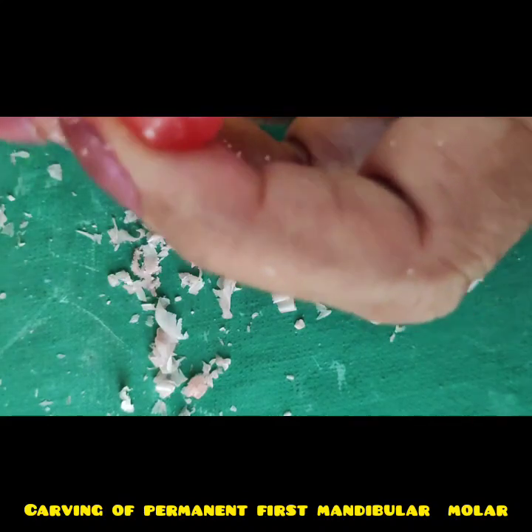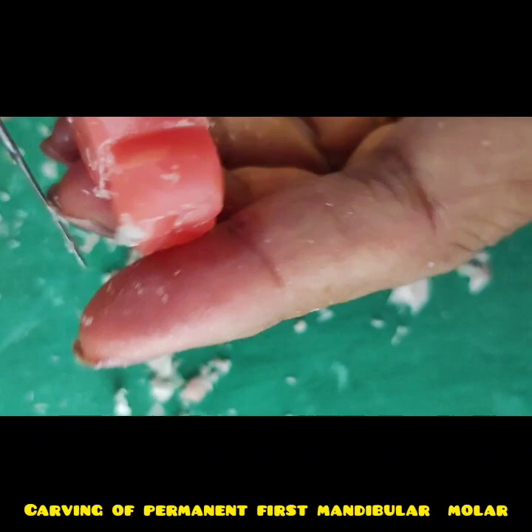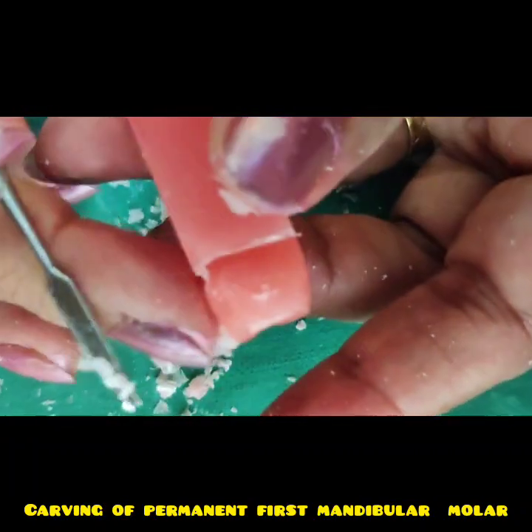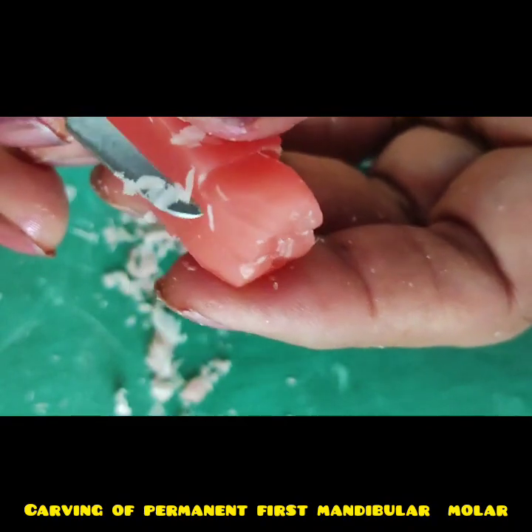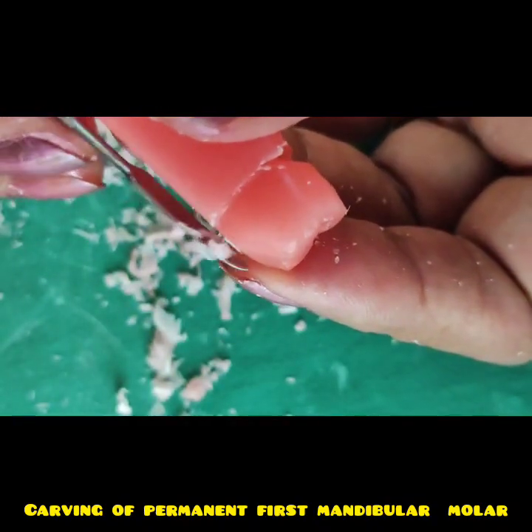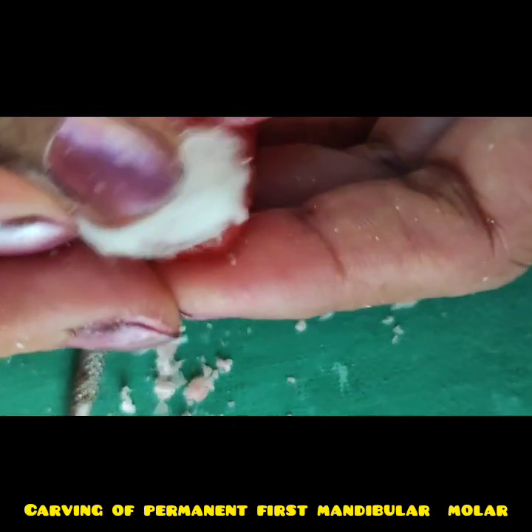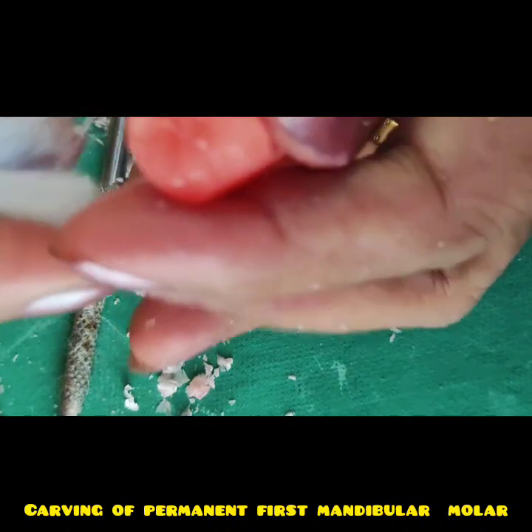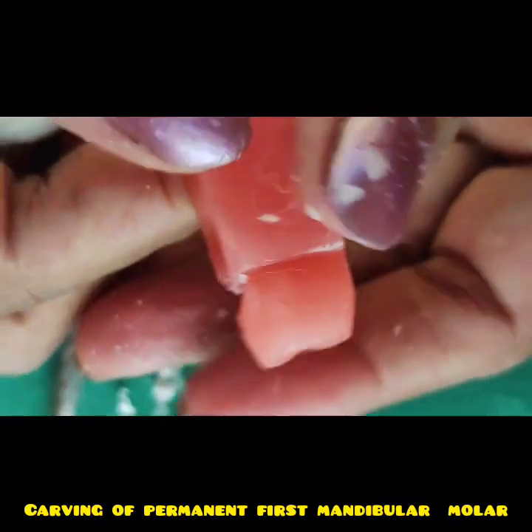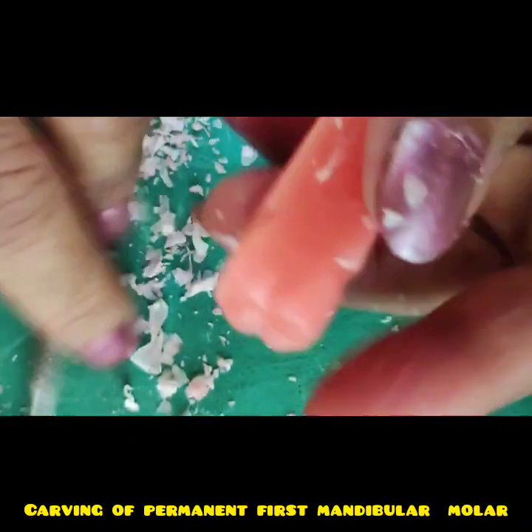Give occlusal convergence to the cusp tips, so that the lingual outline is rounded, and buccally our crown is more prominent in the cervical 1/3. So polish it, like this. So this is our mandibular first molar.